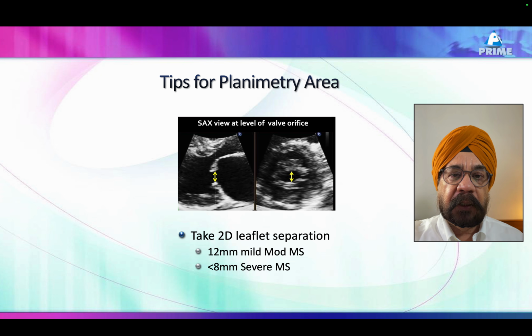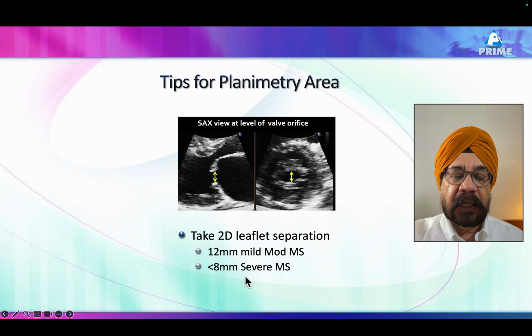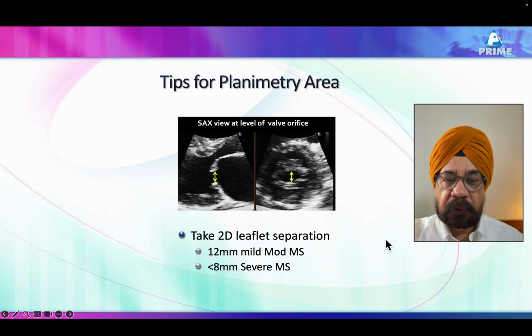Many times you may not be able to get to the tip of the mitral valve, then you may make a rough assessment. You see the tip separation, and if it is less than 8 millimeters, then usually it is a severe mitral stenosis.